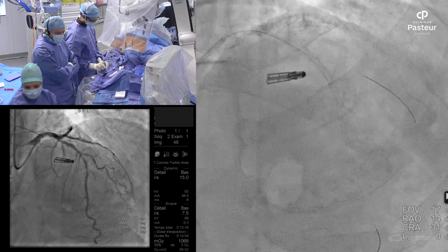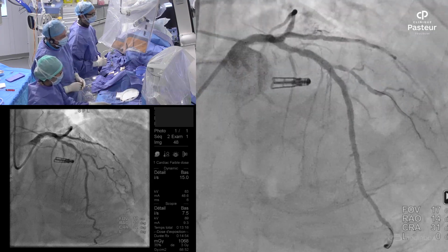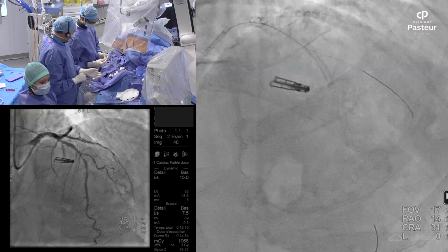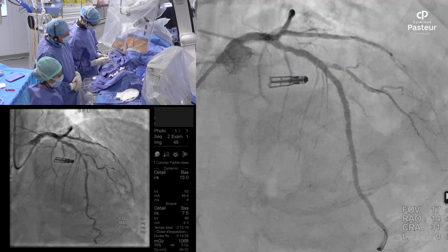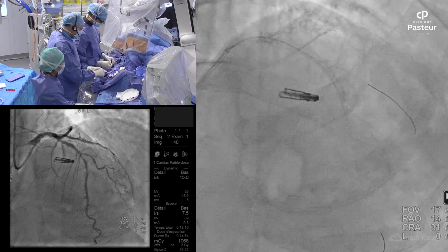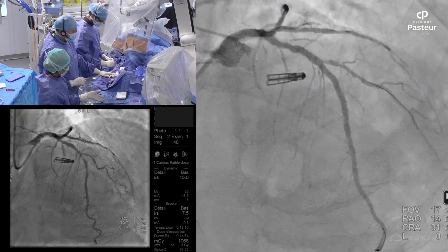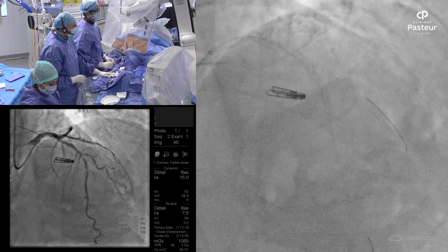I agree with Benjamin. If you want to dilate a little bit more the LAD, where actually the most tight part of the lesion was, you see that the stent is a little bit underexpanded. If you want to do this with a non-compliant 3.5, not only in the proximal part but also after the diagonal, you have the risk of having a shift and impairing the diagonal. So in this case, what I would do is put a 2.5 balloon in the diagonal at low pressure, 5 atmospheres, and then go in with a short balloon below the diagonal for a further expansion. In fact, we will use a 2.0. We will be less aggressive. Yeah, I think you can do either way, really.